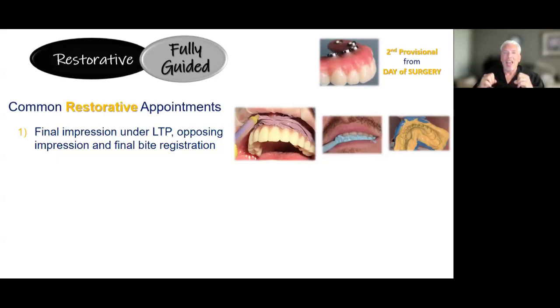We found that for that not to show during patient laughing, talking, smiling, now you get some of them that had a high smile line, but for the majority of people, you put that transition line 3 millimeters above the highest smile line, the highest physical line they can go. So even those patients who give you the big horse laugh, you want to document that because we want to go 3 millimeters above that so you don't see the transition line.